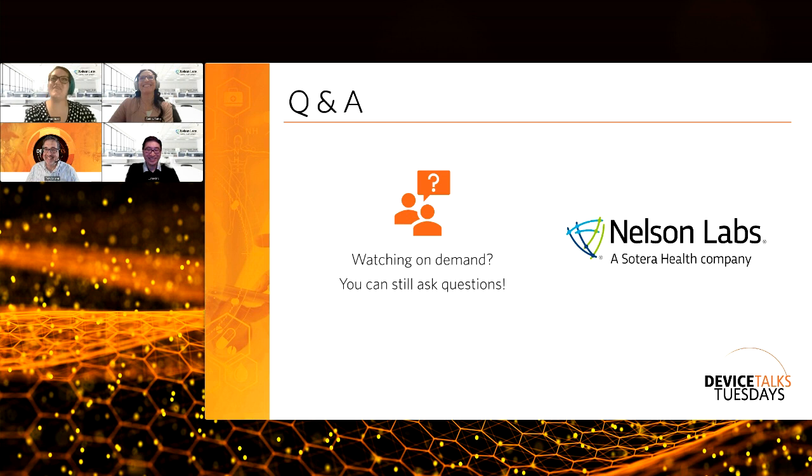Yeah. So, kind of like what Audrey was mentioning earlier, cytotoxicity is maybe a good screening when you're picking materials for different parts of your device. If it's a part that does not contact the patient, then biocompatibility is not something that needs to be addressed. So it's not necessarily something you need to do for every material in your device or every component. But you can, if you want, screen just as a reassurance that the material isn't going to pose an issue in your device. But ultimately, when you're doing your final panel or group of testing, it should be on the final finished device.